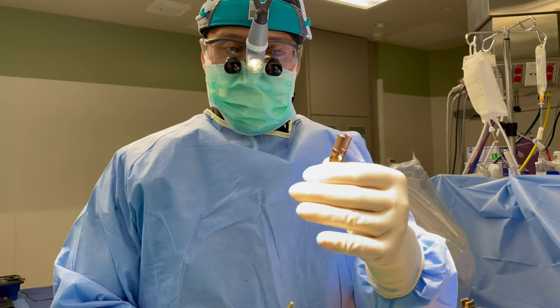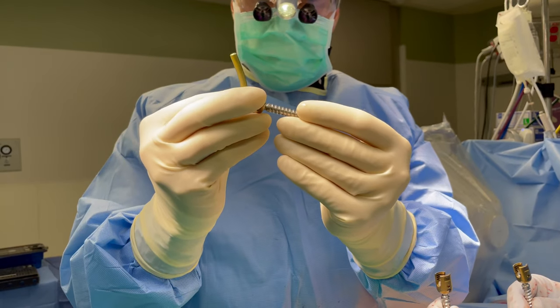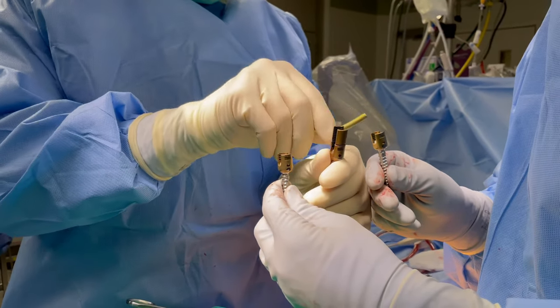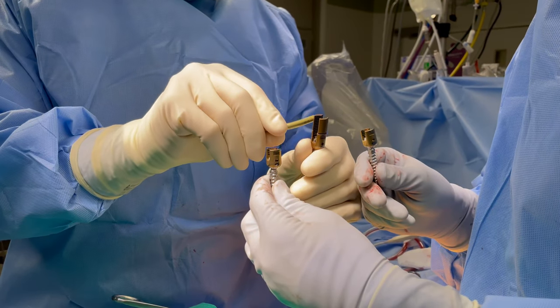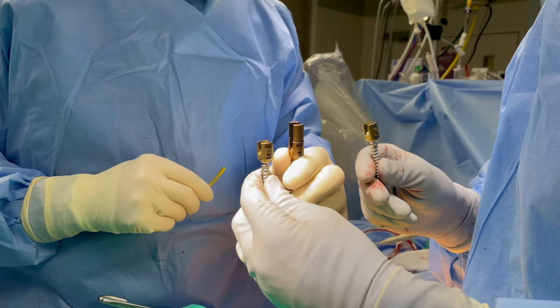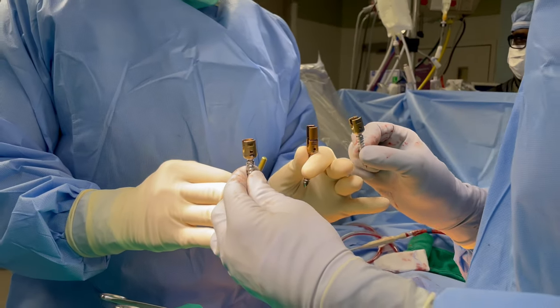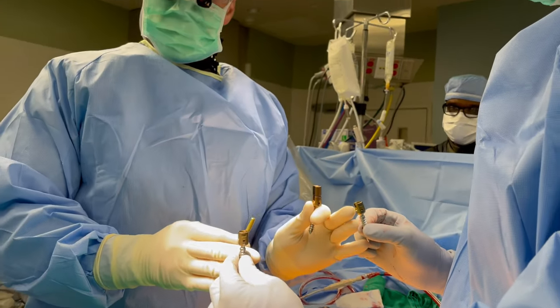The way it works is these are the screws that we put into the spine — they're called pedicle screws. If you look at this screw, it has a tall top, and these have a normal top, and these have a short top. This one is almost probably a little more than double the height of the screws here. The bone we're going to reduce is in between two bones that are normal height.